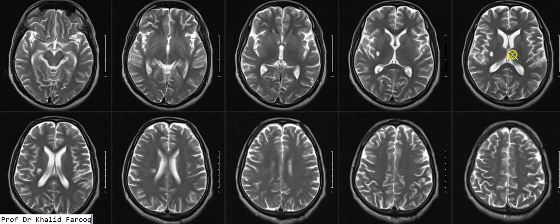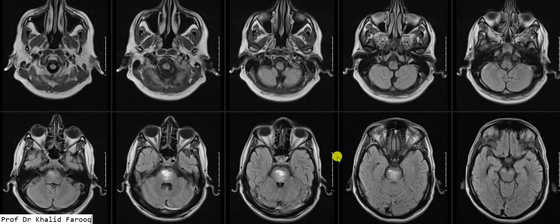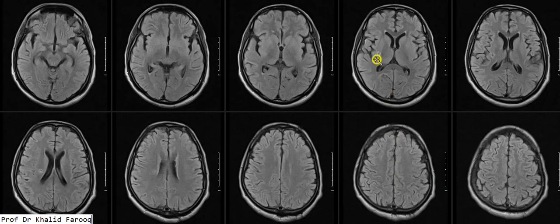Here we have axial images of the FLAIR sequence. We can see abnormal signals in the central portion of the pons, consistent with pontine hemorrhage, and old ischemic changes noted in the posterior portion of the right basal ganglia.